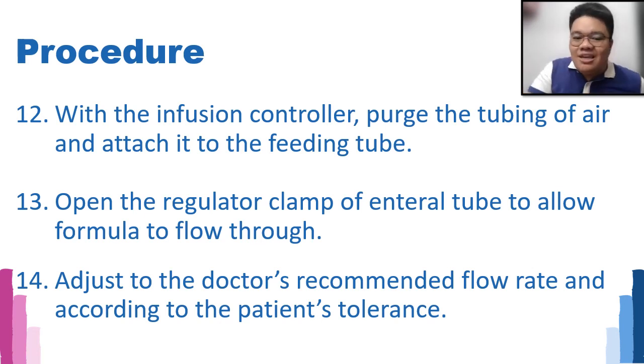Then you open the regulator clamp of the enteral tube to allow the formula to flow. And then you adjust according to the recommended flow rate by the doctor and according also to the patient's tolerance.